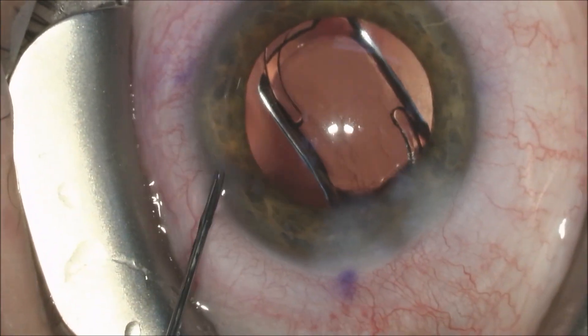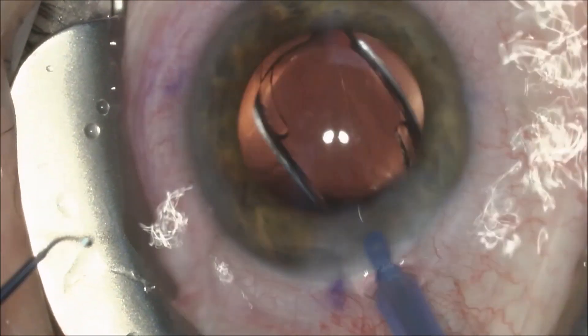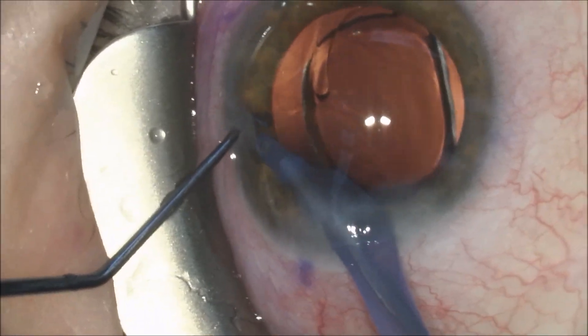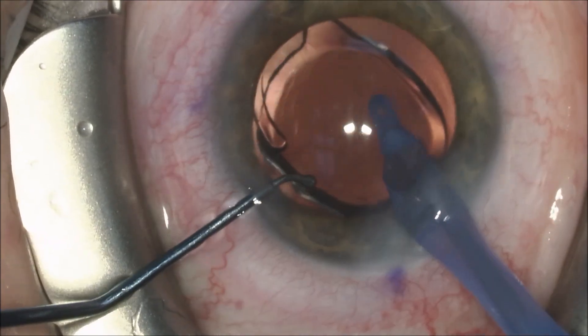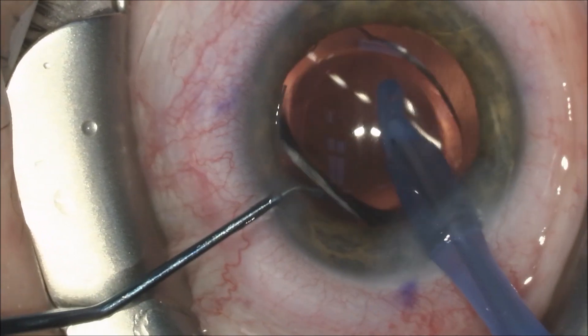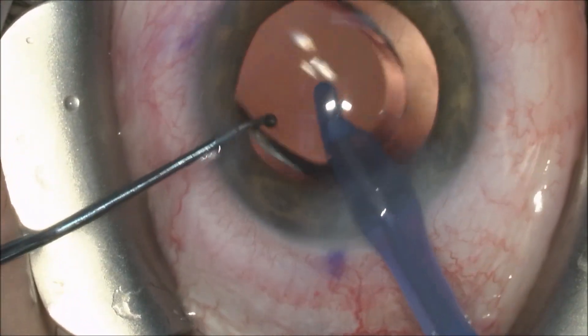We're going to hydrate the main and side port incisions. This is an iHance intraocular lens by Johnson & Johnson, and we'll make sure it is in the confines of the laser capsulotomy, and we remove the cohesive viscoelastic and center the intraocular lens.